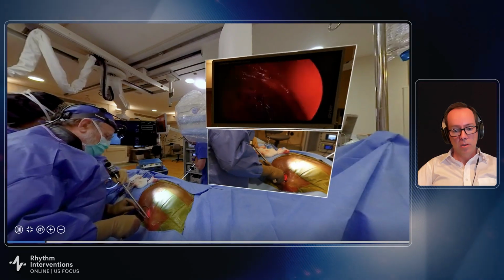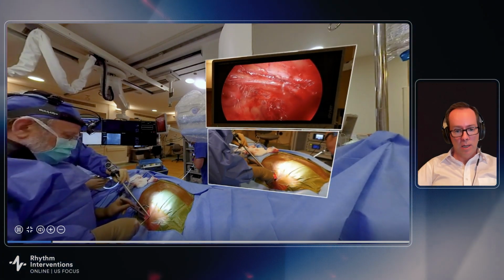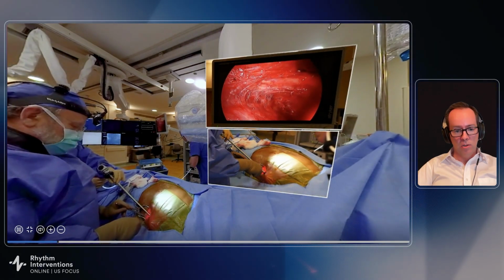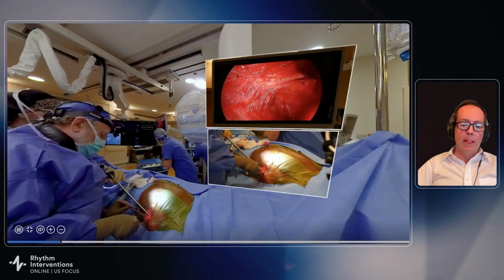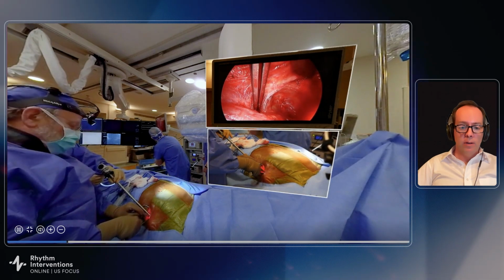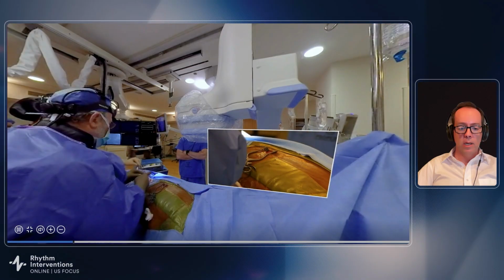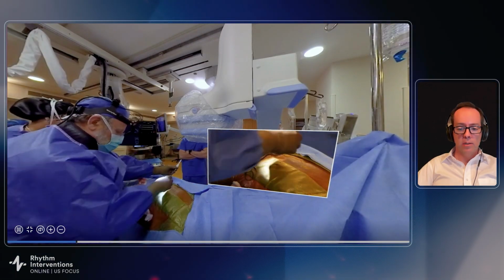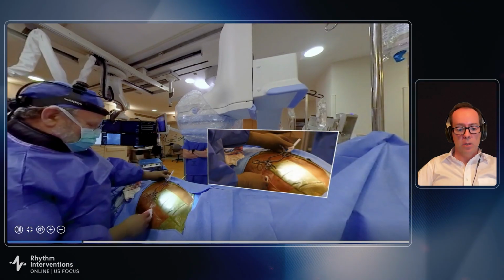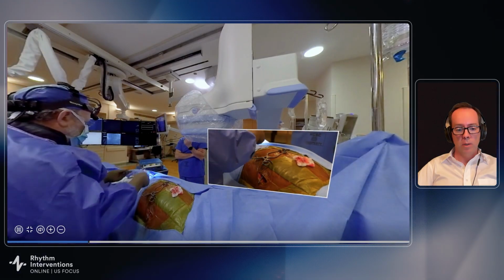He's showing this intramuscular approach where the latissimus is on the right side of that scope. He's just showing that for the audience, and the serratus is on the anterior side. This is the so-called bloodless approach. I don't know if I can say they're truly bloodless. There are a lot of lateral cutaneous neurovascular bundles that you can get into as long as you recognize them. And that's actually a good sign to me that I'm in between the plane. You can clamp them off and avoid bleeding.